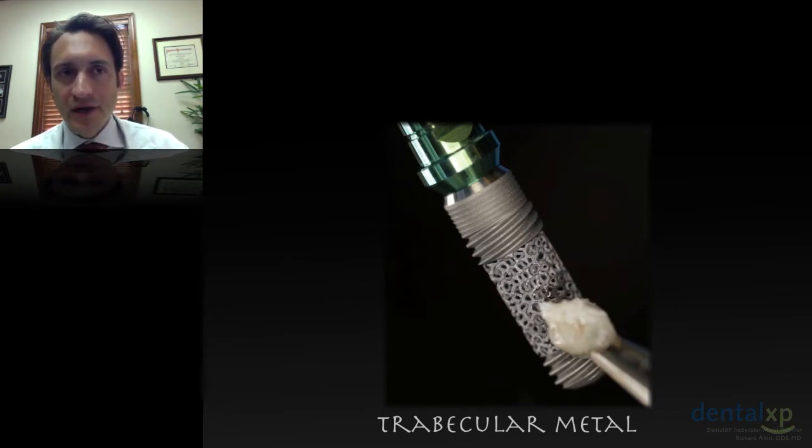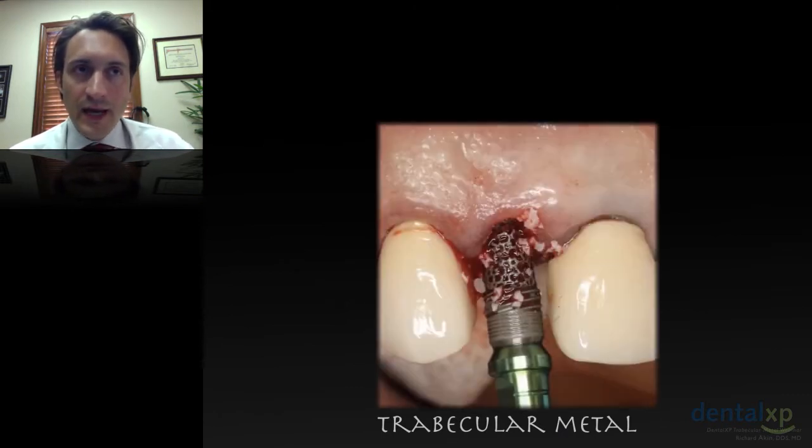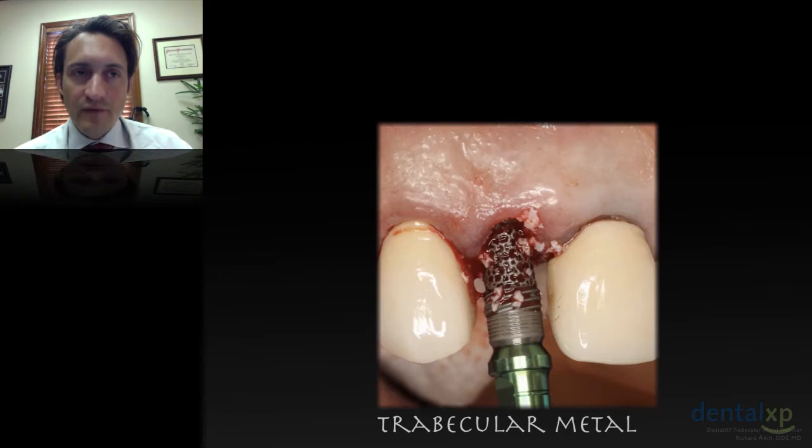And the PRGF in this case not only aids in the delivery of growth factors, but is nice as a graft retainer and a graft delivery medium. And I place the bone into the socket, and I will kind of compact the bone against the buccal wall, then engage and place the implant. I'll engage the implant near the palatal area. Obviously, I try to keep the bone graft out of the osteotomy site, because then we can have problems with full seating of the implant.